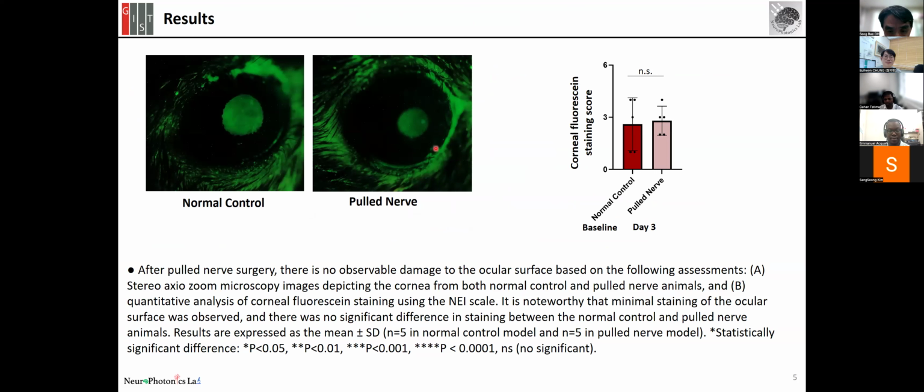So I'm just counting these dots, 1, 2, 3, 4. Potentially that may interfere if there are many inflammatory marks. No, Professor. It will only interfere if there is very high inflammation. If there is surface activity, corneal fluorescence does not extend below the cornea. So only corneal activity is showing, not the depth.